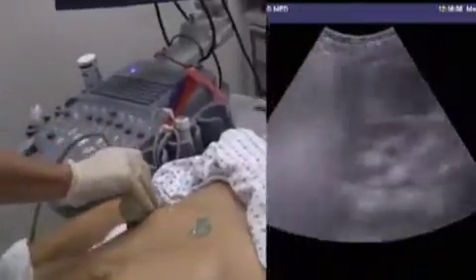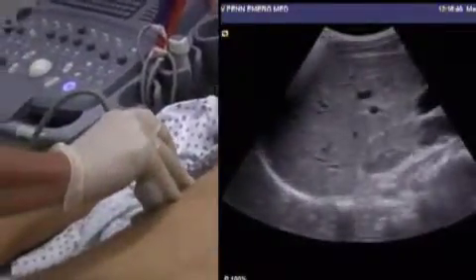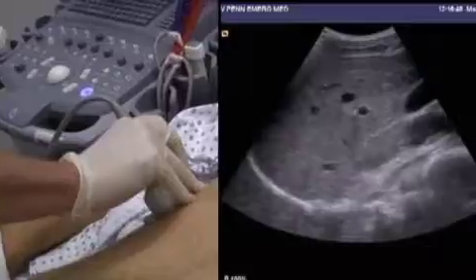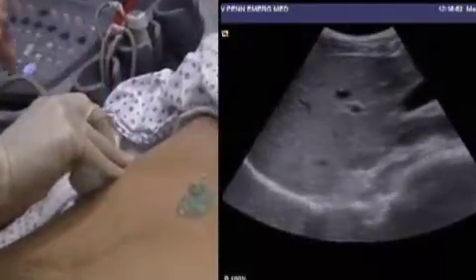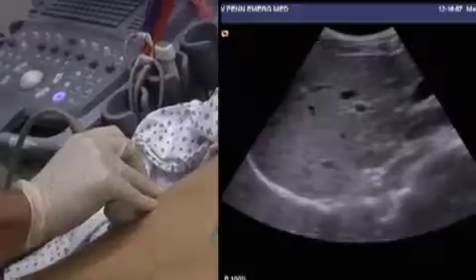We start on the right upper quadrant, adjust for depth and gain — in this well-lit room the gain tends to be higher than it usually is in a darkened room. With the probe parallel with the ribs and the probe pointer up towards the patient's axilla at about the 10 o'clock position, we see here on the screen.